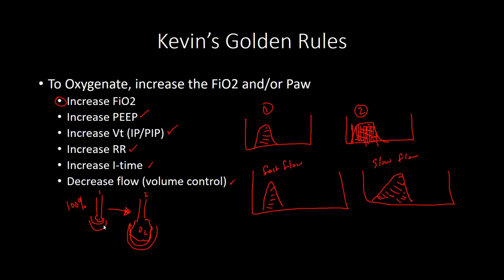The Avia? Yeah. Or okay, it's not the 840 or anything, right? No. Okay. So on the Avia, you can go to the screen where you can put all the parameters in, where you can see them going across the screen like that. What I want you to do is look at the mean airway pressure.